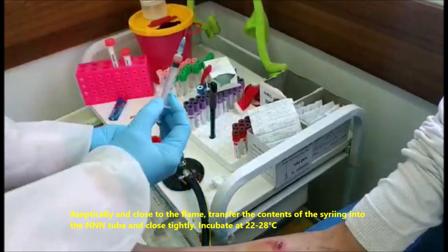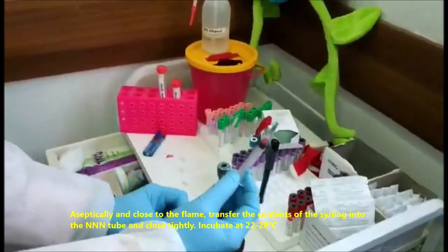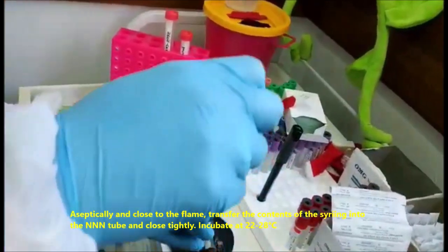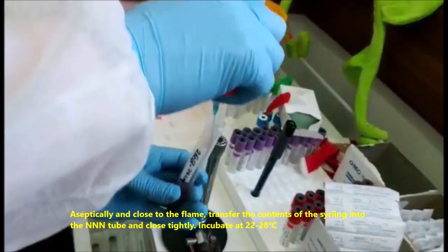Aseptically and close to the flame, transfer the contents of the syringe into the NNN tube and close tightly. Incubate at 22 to 28 degrees centigrade.